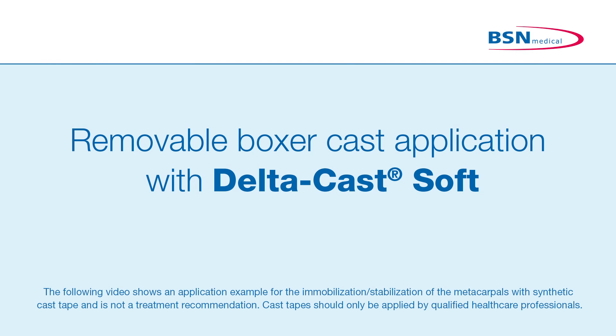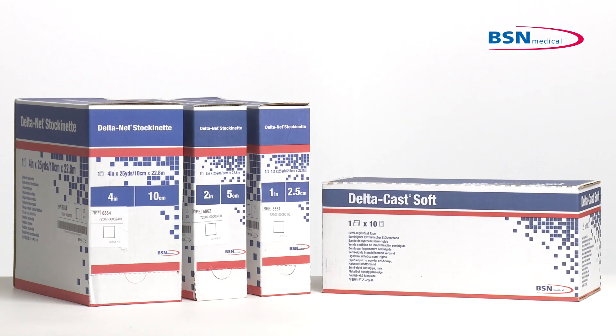Deltacast Soft is a semi-rigid polyester cast tape for the functional immobilization in the treatment of fractures and soft tissue injuries when limited movement is allowed. For indications where immobilization or stabilization of the metacarpals is required — for example, distal fractures of radius and ulna.